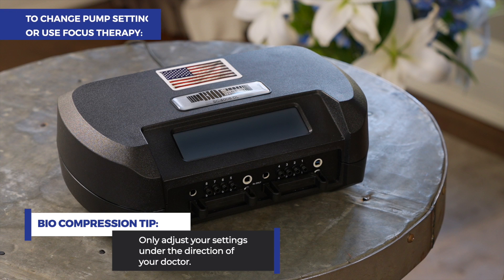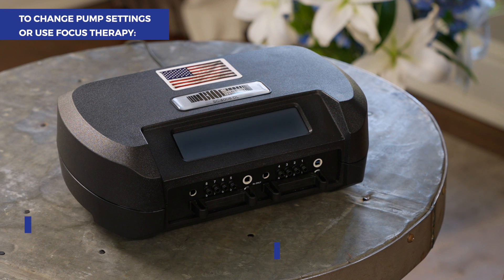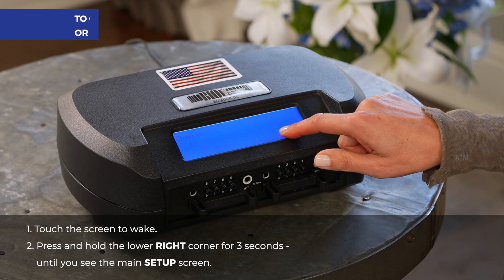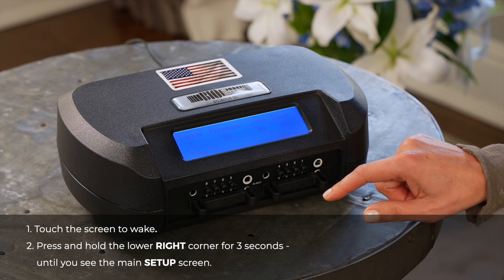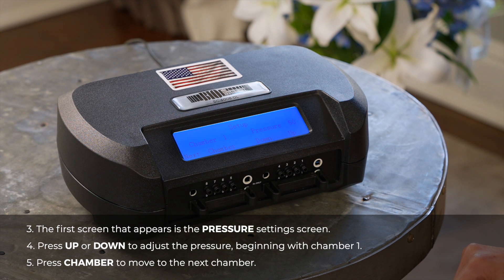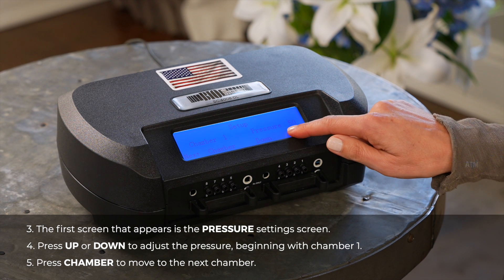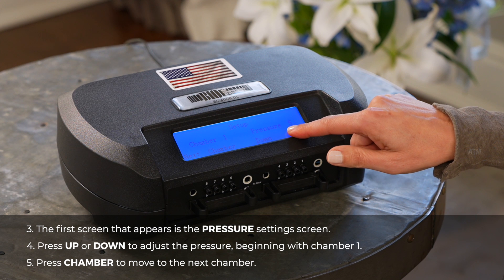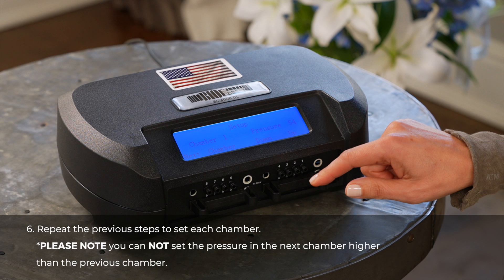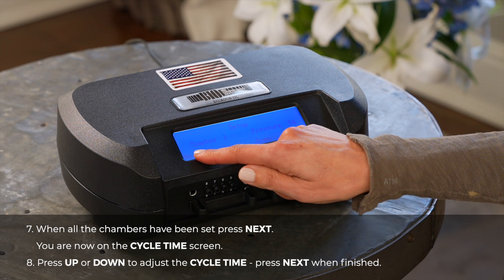To change pump settings or use focus therapy, touch the screen to wake. When the home screen lights up, press and hold the lower right corner of the touch screen for three seconds until you see the main setup screen. The first screen that appears is the pressure setting screen. Press up or down to adjust the pressure, beginning with chamber one, and press chamber to move to the next chamber. Repeat the previous steps to set each chamber. Please note: you cannot set the pressure in the next chamber higher than the previous chamber. When all the chambers have been set, press next.